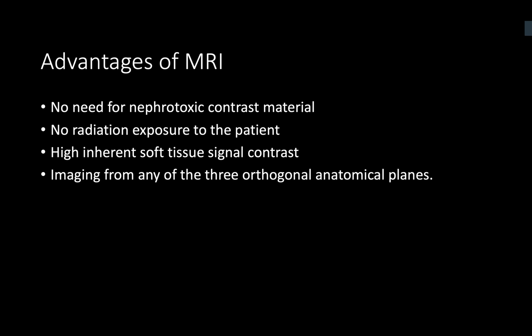So dynamic contrast enhance is important, especially in determining, for instance, whether a PIRADS-3 lesion becomes a PIRADS-4, or in terms of upstaging the PIRADS score. So this is where dynamic contrast enhanced images become important.